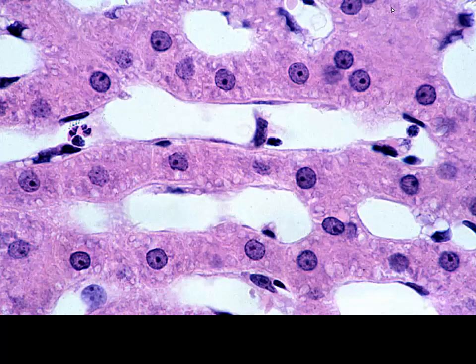Now, as we look at the hepatic cords, these are the hepatocytes that basically define the boundaries between sinusoids. So here we have a hepatic sinusoid. Here we have a cord of hepatocytes, a sinusoid, a cord of hepatocytes, and we can recognize the endothelium lining the sinusoid. Remember, that's our sinusoidal type 3 capillary endothelial cells, and there we can see that as well. The lighter area beneath that is going to be our space of Disse, and we'll see that a little bit better once we get to some EM pictures.